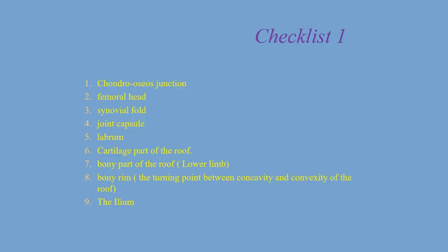To further standardize things, Professor Graf introduced two checklists: Checklist 1 and Checklist 2. Checklist 1 contains 9 important structures that we need to identify in every image to consider it suitable for diagnosis. These 9 structures are: the chondro-osseous border, femoral head, synovial fold, joint capsule, labrum, the cartilaginous part of the roof, the bony part of the roof, the bony rim — which is the turning point between concavity and convexity of the roof — and the ilium.